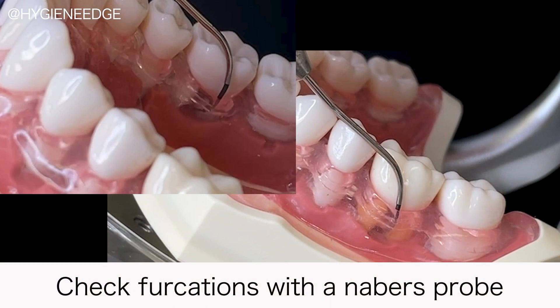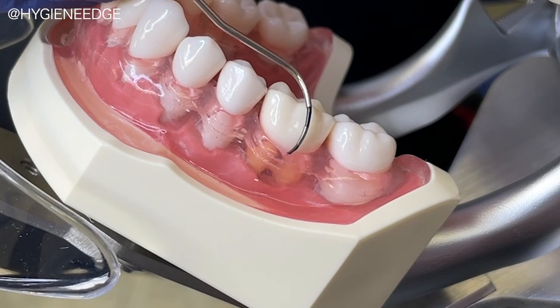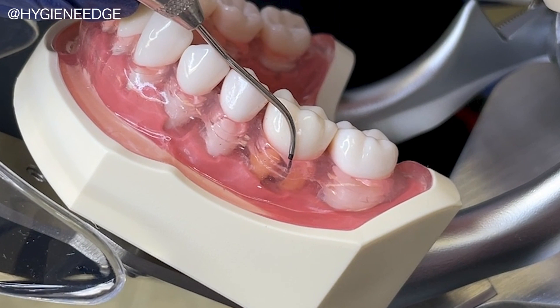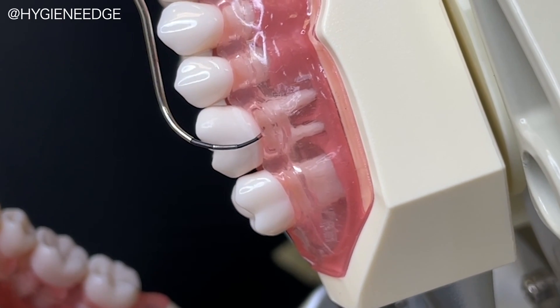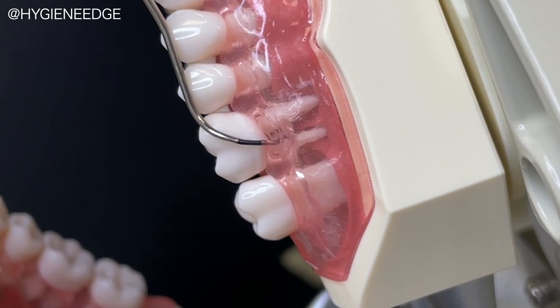Another technique to practice on a model with clear gingiva is furcation detection with a Nabers probe. You can easily see the furcation from the middle of the buccal and lingual of the mandibular molars. On the maxillary molars, you evaluate them from the direct mid-buccal.